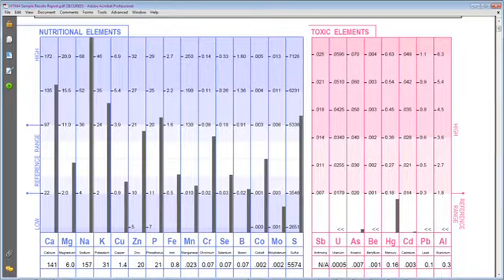Okay, in this video I'm going to be showing you a sample chart of a 59-year-old female who had done quite a bit of traveling in the previous 2.5 years or so, and she wanted to get a baseline reading. The charts we get back from Trace Elements labs are very clear. And you'll see the headings here.